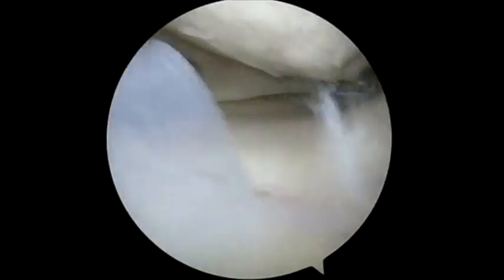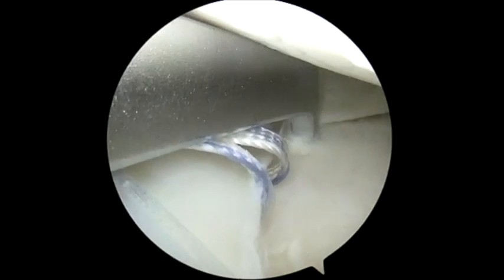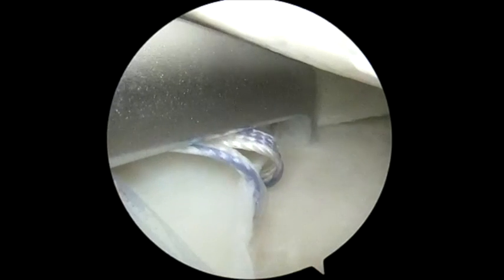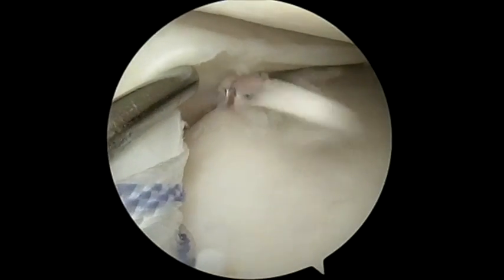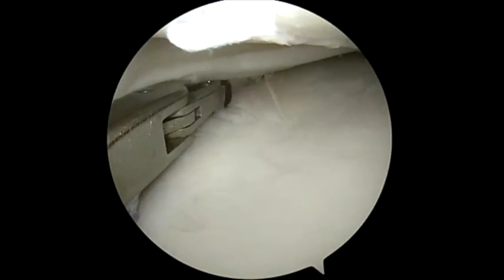Following this, using the Passport system, we place our drill guide and pass our tunnel just medial to the tibial plateau. You can see this is underneath the meniscus. You can see we've completed this drill tunnel using the probe to elevate the meniscus.